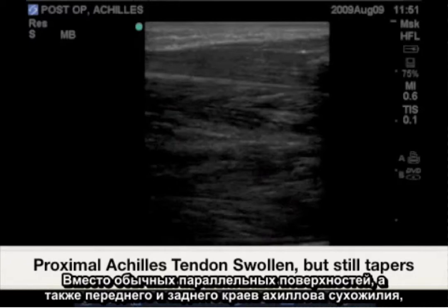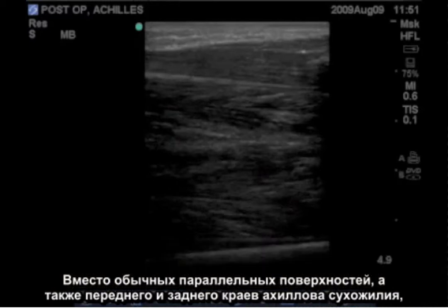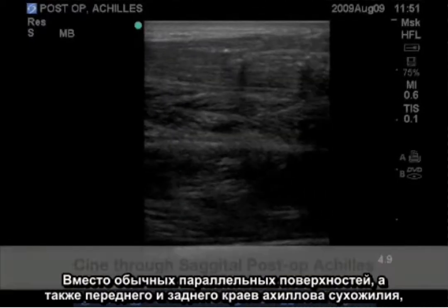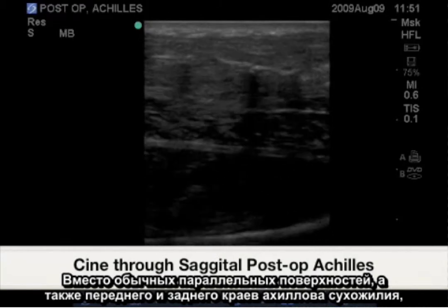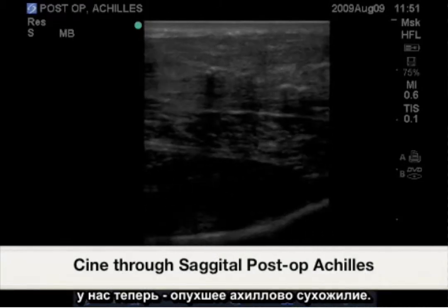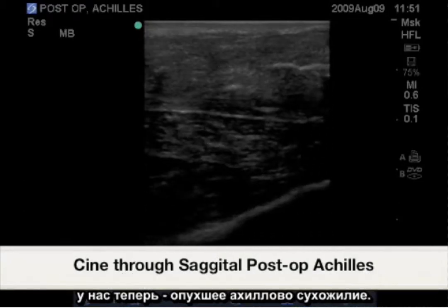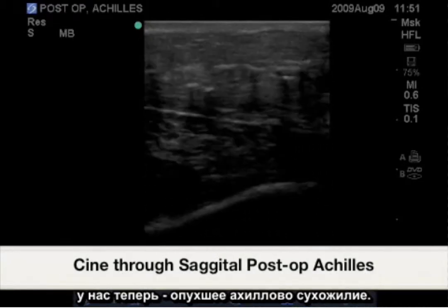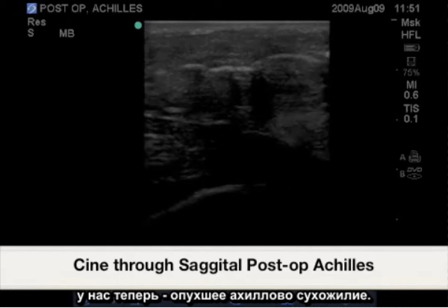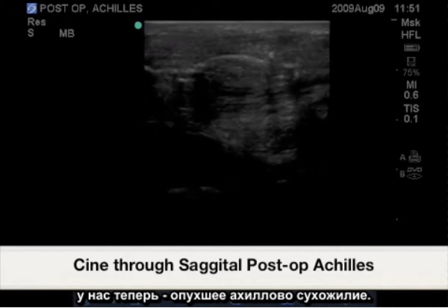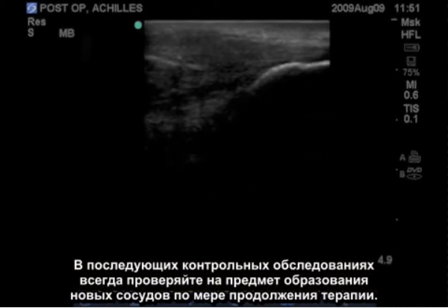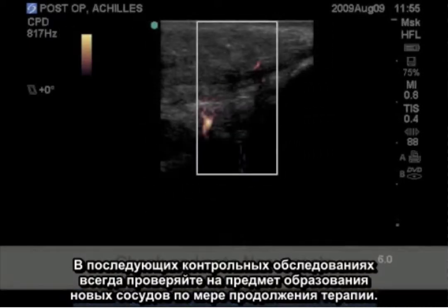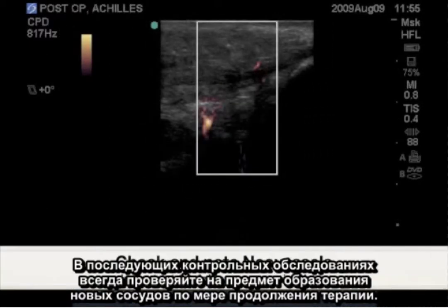Instead of the normally parallel surfaces of the Achilles tendon's anterior and posterior margin, we now have a swollen Achilles tendon. In follow-up examinations, always check for neovessel formations as therapy continues.